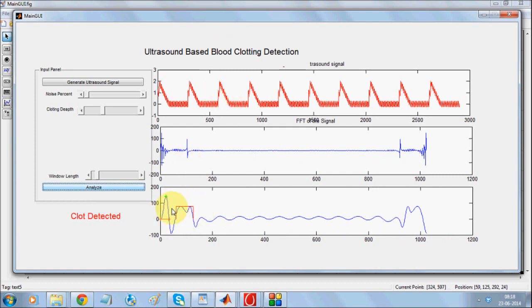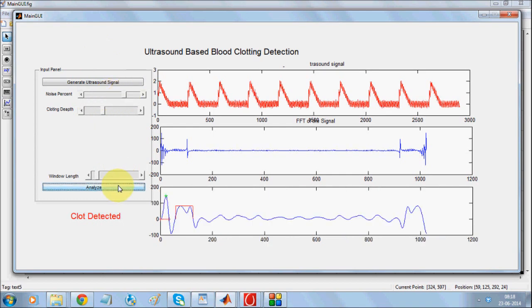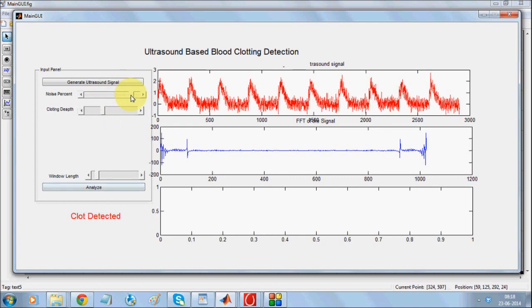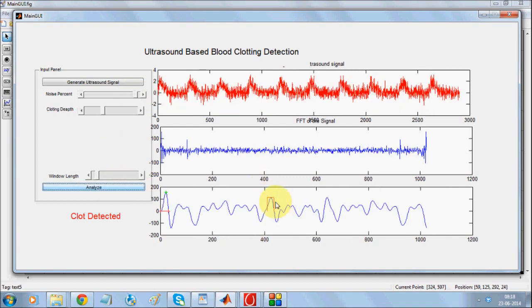Detection is based on identifying an alternative peak along with the main peaks. The algorithm tries to detect that alternative peak. The algorithm is so robust that even when you increase the noise significantly and run analysis, you are still able to detect the signal. Even with a heavy noise percentage, the analysis is still able to detect the presence of the clotting peak.